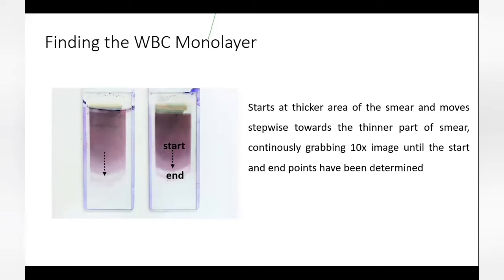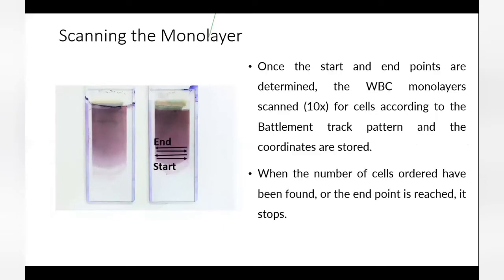So for WBCs, there is a hardware and then there is a software. You send the stained slide through the machine. The machine is able to identify a start point and an end point, just the way we would use the last one-third of the slide smear to review. It will start grabbing all the images. So there is a camera basically, and as the robotic arm takes the camera and the eyepiece of the microscope around the area of interest, it will capture images continuously, and then it will just stitch them together. And this is the technique.